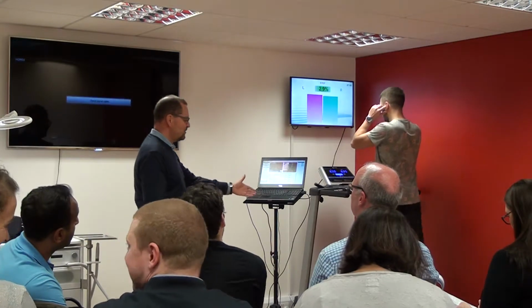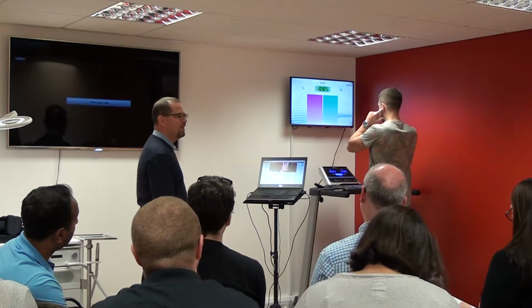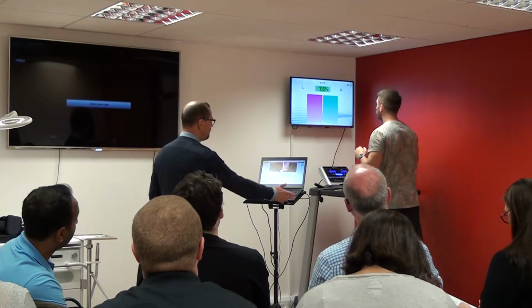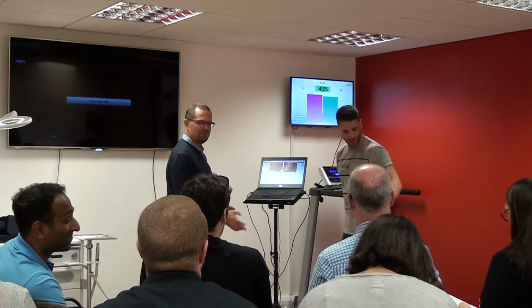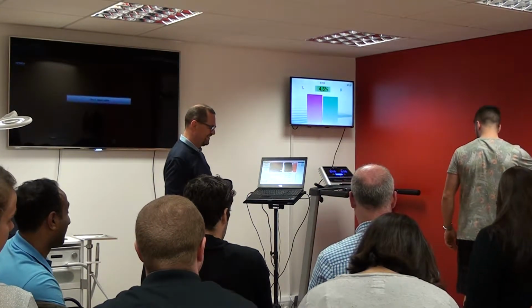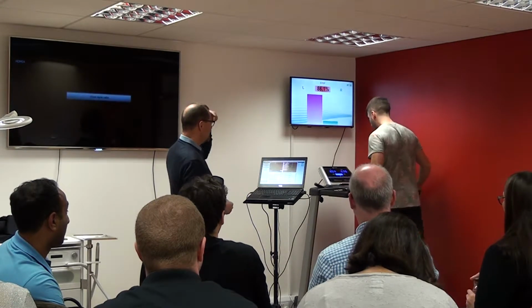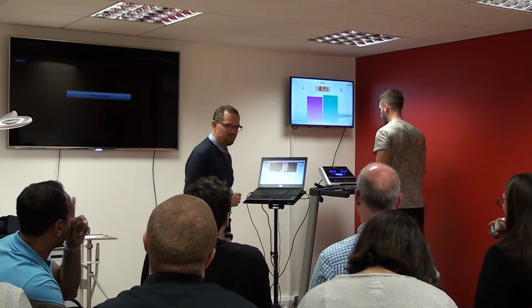Now we can try to put something in the shoes, or let's say in this way. We can try barefoot and see. Jump up, jump off. So let's try. Yeah. Take out the shoes. We do it on the fly. There? Yeah. Okay, of course, now the statistics for just a second or two. Okay, and we are back.